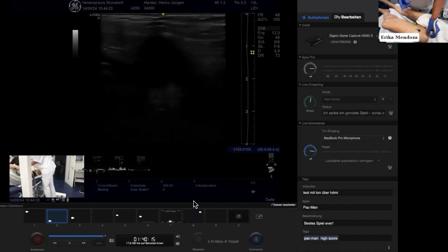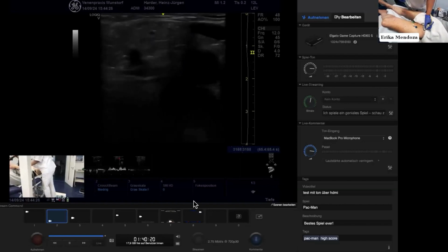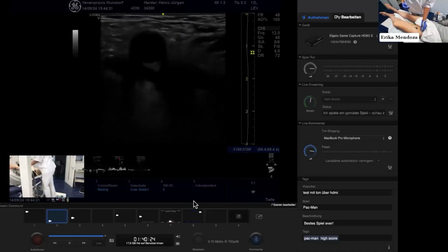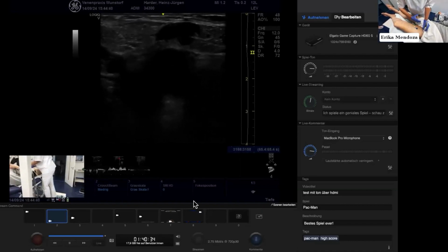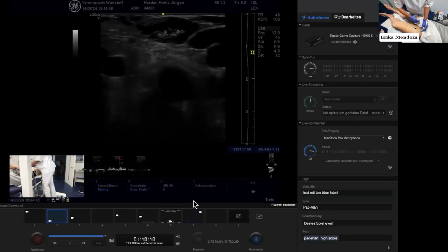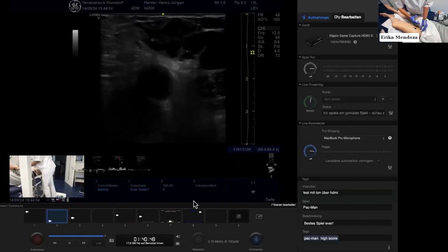So I'm very eager to see where you inject it, Erika. Yes, please. I am injecting it, you see, this is the aneurysm of the accessory anterior. And I will go beside the vein, not inside, and start infiltrating. You see the infiltration, yes?